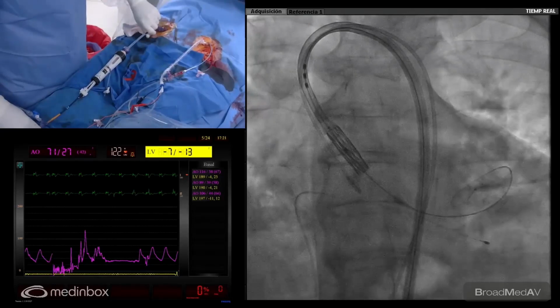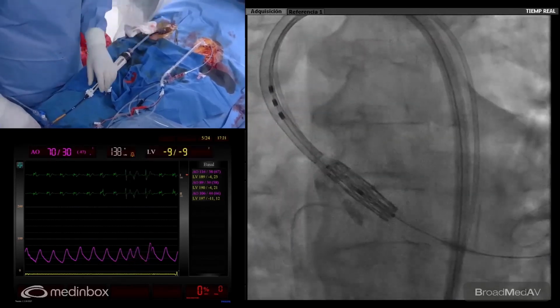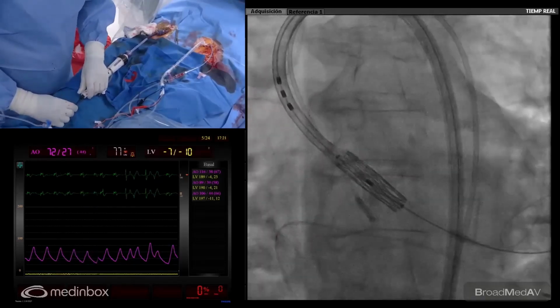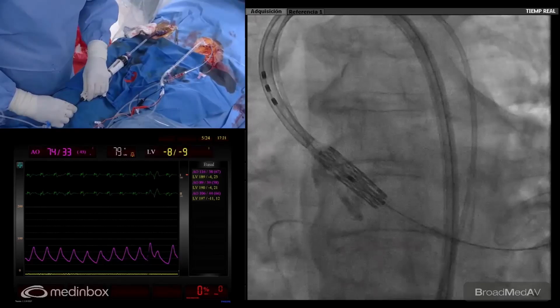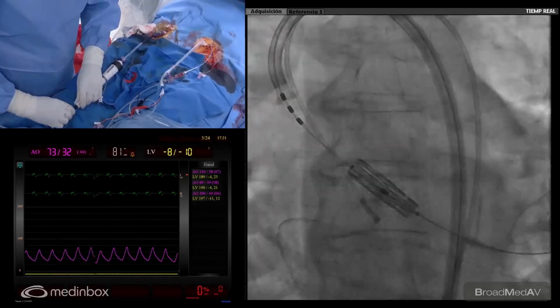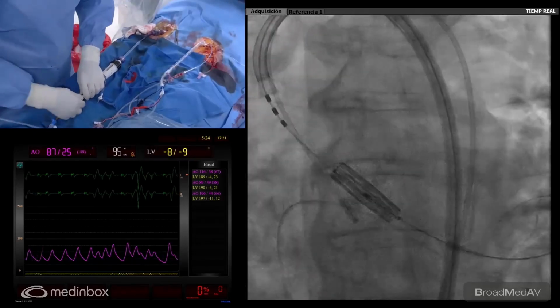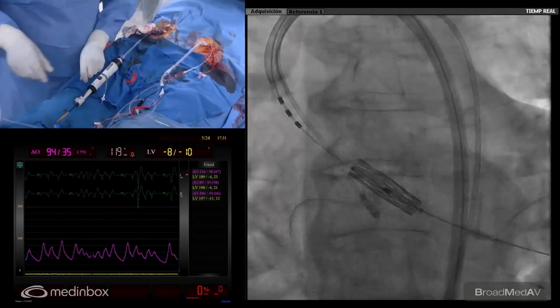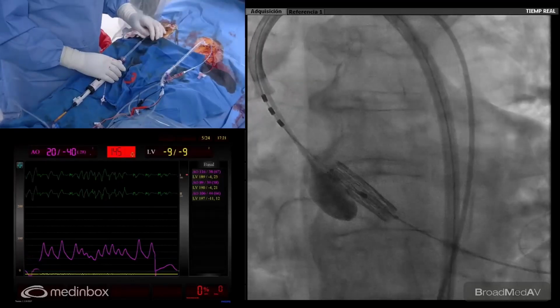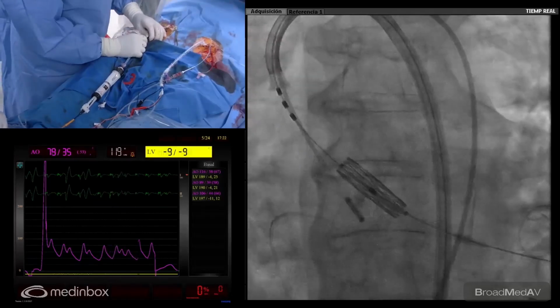Will you zoom, Claudio? Okay. Probably there. I will retrieve the sheath. Unlock. And I'm going up. There. It's okay. Okay, Mariana? It's locked. Okay. Will you test? Okay, throw a little bit higher. Do you agree? But not too much.